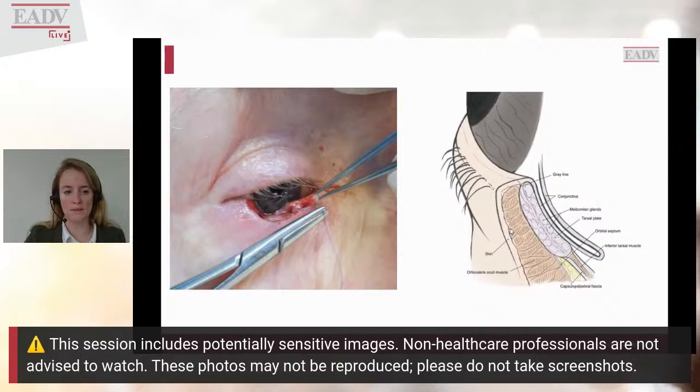When the patient is free of the basal carcinoma after you've checked your slides with frozen histology, then we put in our stitches, and I like to work with Vicryl 6-0 sutures. And I've put in this drawing of the anatomy of the eyelid because it's important to realize that when you reconstruct a full thickness defect on the eyelid, you close it in 2 layers.